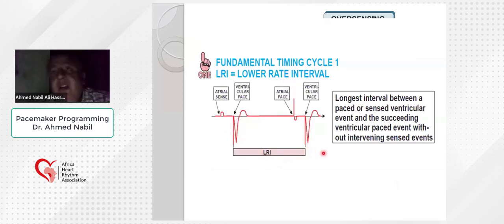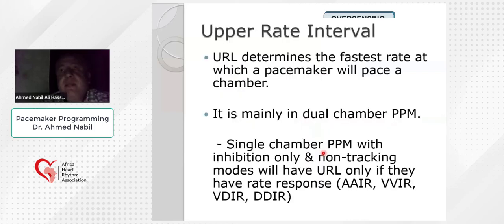So this is the lower rate interval. Of course, the lower rate interval is in single chamber pacemakers, and it is very important in single chamber pacemakers.